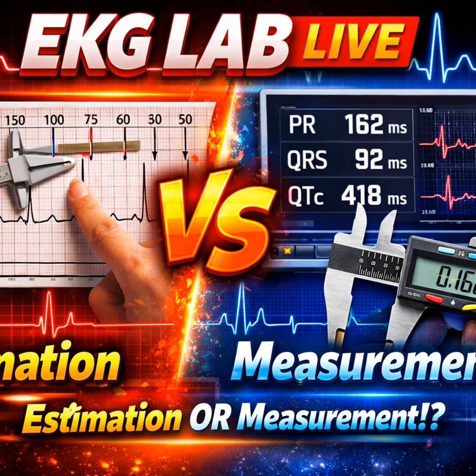But even experts miss things when they stop measuring. Look at left ventricular hypertrophy, LVH. The voltage criteria are strict. You need the S wave in V1 plus the R wave in V5 or V6 to be greater than or equal to 35 millimeters. You cannot eyeball 35 millimeters across two different leads accurately. You physically have to count the boxes. If you don't count, you miss the hypertrophy, you miss the strain pattern, and you miss the underlying hypertension.